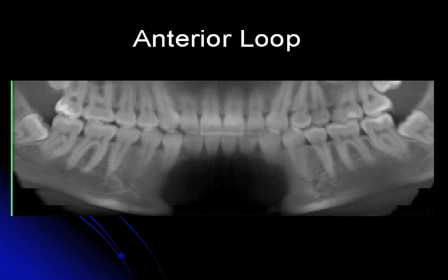So it's absolutely unique in every individual anatomically. It's not seen in every person, not everyone has an anterior loop, but some patients do, and that can be very important to identify.